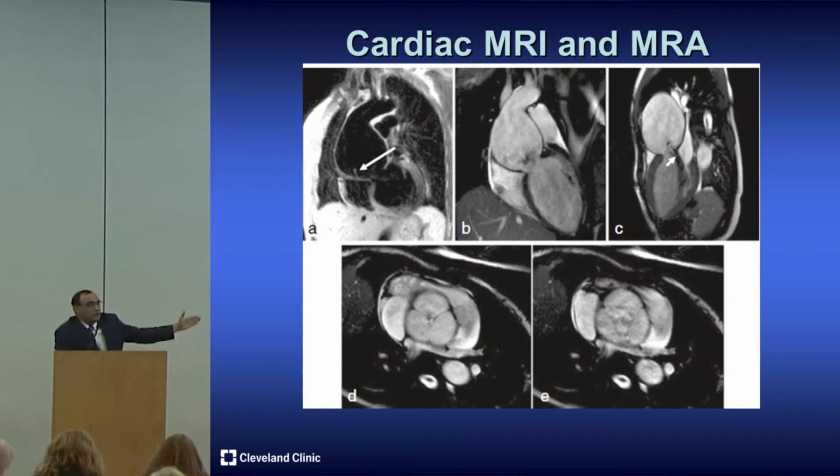The problem compared to CT is it takes a long time. Some of you who've had MRIs know it's like 35, 40, maybe up to an hour in a donut-shaped hole where you're claustrophobic and all kinds of noises are happening. But it is a very good alternative. In fact, people would argue an equivalent alternative to CT scan if you can tolerate it.